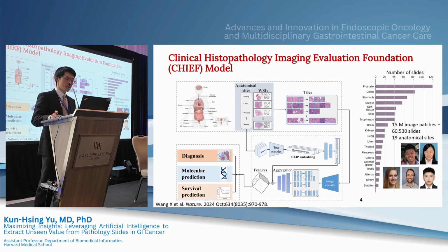And when we get these pathology samples, we first scan them into whole slide images, or WSIs, and we tile them into manageable patches where we can input them into an image encoder to extract information in a machine understandable format. And another innovative bit about this foundation model is that we also leverage some text information in the accompanying pathology report. And for those text information, we use a text encoder to extract the text embeddings from those information.